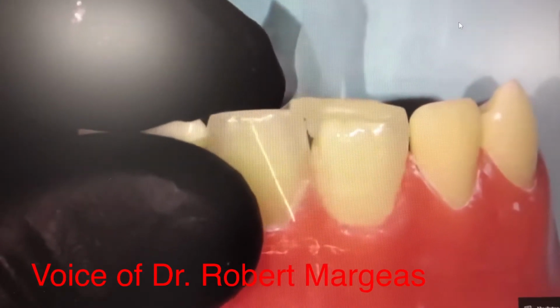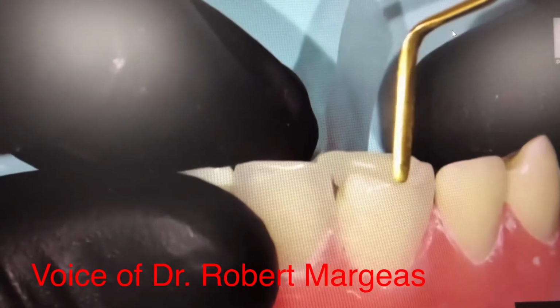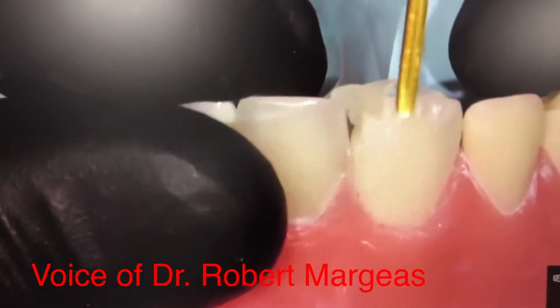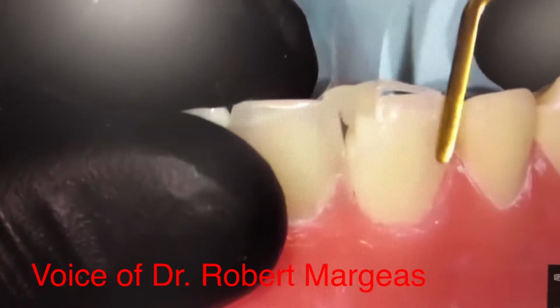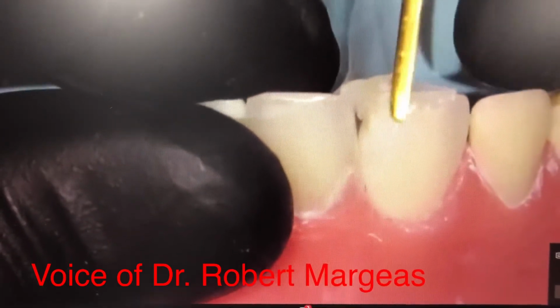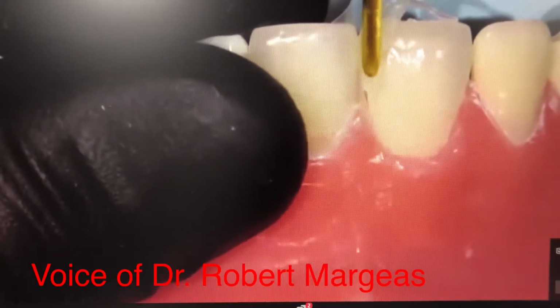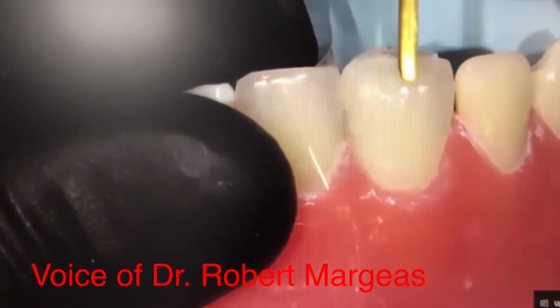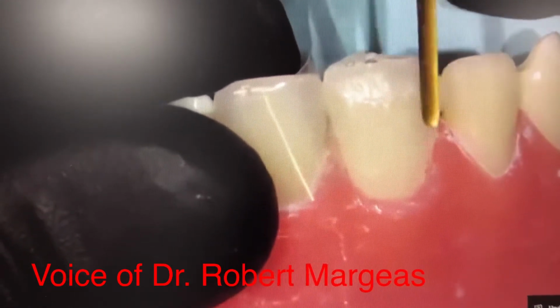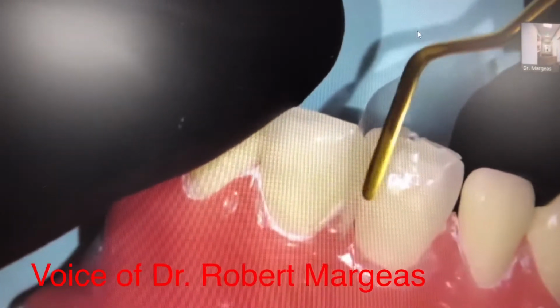Where you get bubbles is when you start folding it on itself. So what I do is I start here, and what I want to do is physically push this in, force this between the lobes to create and keep the translucency. I cleave it off, and I'm forcing that in between, and then when I get to the corner, I turn this up like that. Okay? I turned it up, and then I'm physically forcing this in between the lobes. Now, I am not making this thicker than the thickest part of the dentin, okay? It's not thicker to the facial than what the dentin is, and I'm filling it in.